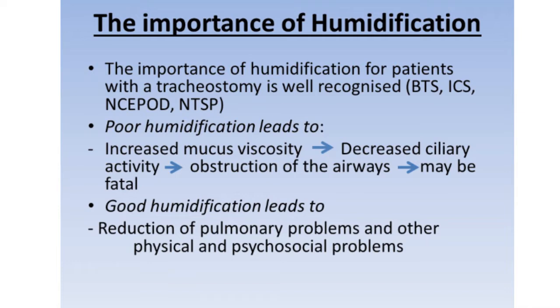The importance of humidification for patients with a tracheostomy is well recognised. Poor humidification leads to increased mucus viscosity, decreased ciliary activity, obstruction of the airways, and it may be fatal. Good humidification leads to reduction of pulmonary problems and other physical and psychosocial problems. In normal airways, air is warmed, moistened and filtered as we inhale.